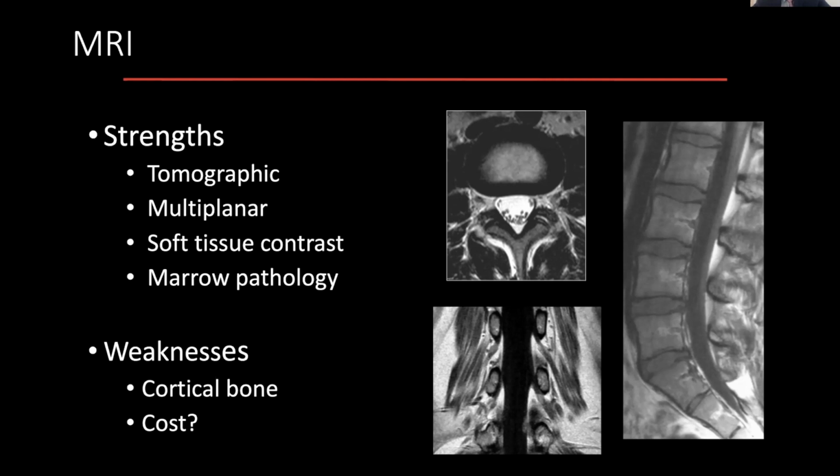And without going into the physics too much, in terms of making these measurements, we know that different types of tissues have different measurements relative to one another. So looking at these individual measurements and forming a map of those measurements of the tissues relative to one another, we can decipher different tissues from one another.